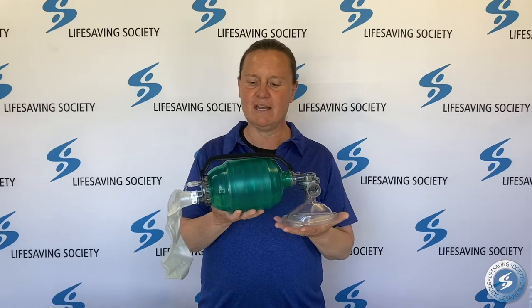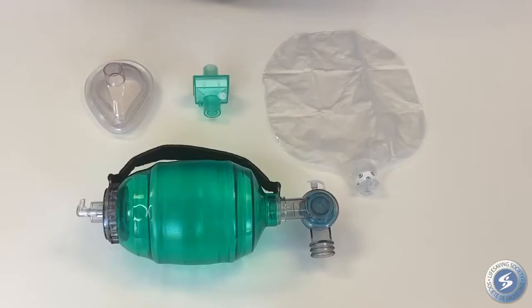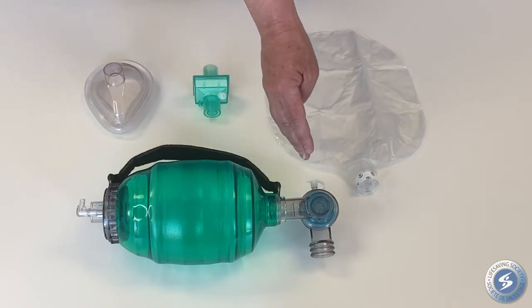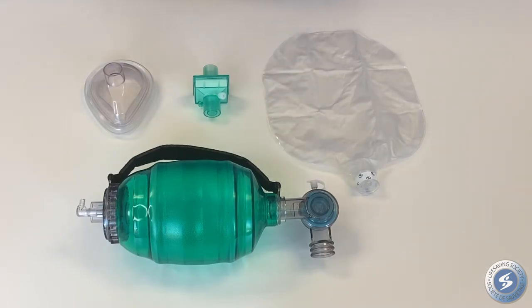This is a bag valve mask. It's a handheld ventilation device used on victims that are not breathing effectively. There are three main components: a self-inflating bag, a one-way valve which allows air to move from the bag to the victim, and a mask which forms a seal around the victim's mouth and nose.